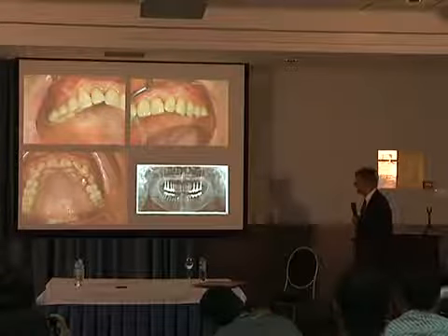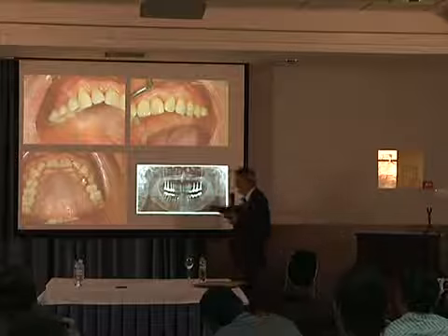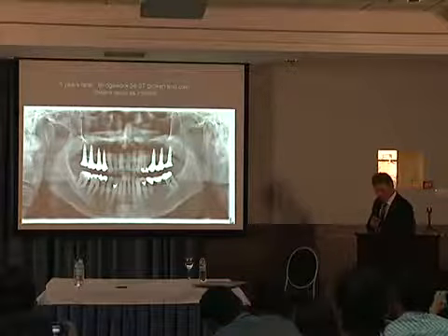Реабилитация. Restoration. Some years later, now this bridge broken. Через несколько лет сломался с левой стороны нижний мостовидный протез. Patient still happy. Пациент остался доволен. But here, okay, bridge broken.